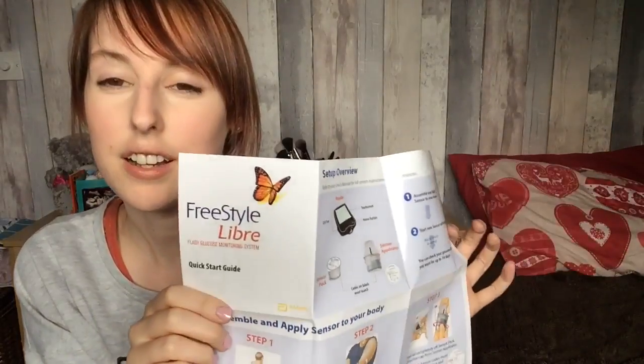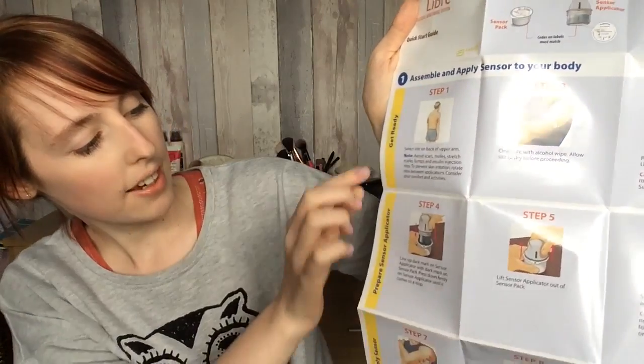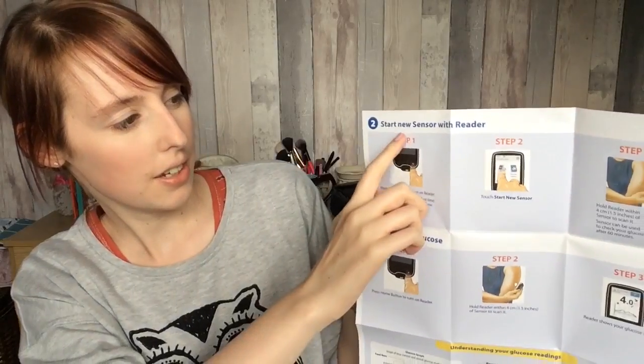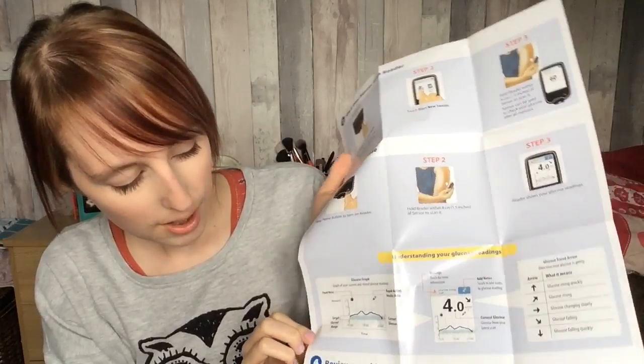The quick start guide is what I will turn to. It's got the setup overview, how to apply the sensor, how to prepare the sensor applicator, and how to apply the sensor. On the back it has how to start a new sensor with the reader, check your glucose, and also understanding the graphs and reviewing the history stored on the reader.